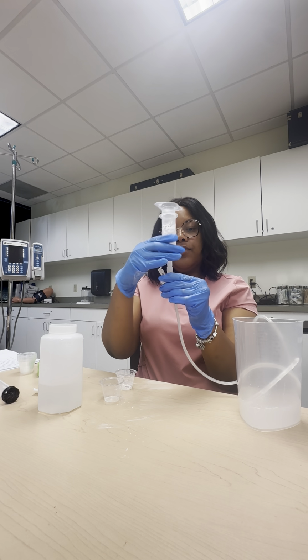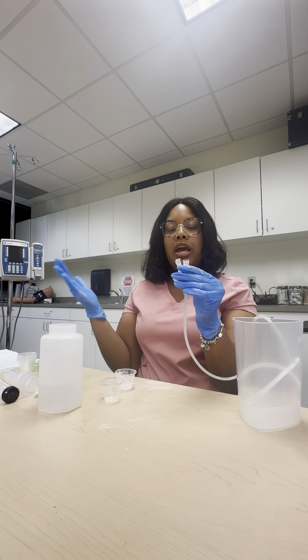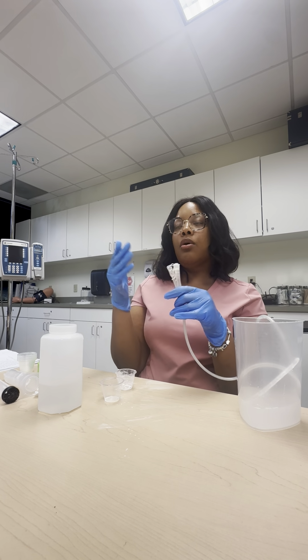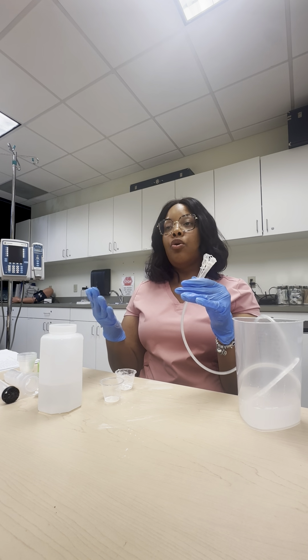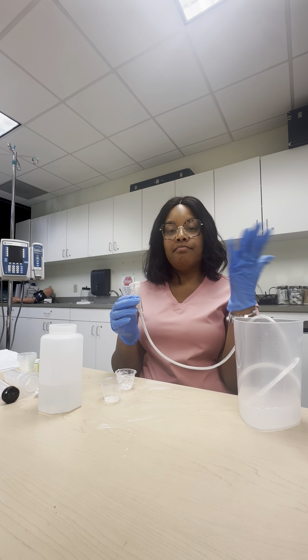After you finish, all you have to do is disconnect here, and make sure you clean your plunger and your syringe off. You want to put the cap back on the peg tube, and you're good to go. If your patient was actually getting peg feeds and it's not contraindicated in the order, or it doesn't interact with the medications, you can actually start your peg feeds back up. And that is that.